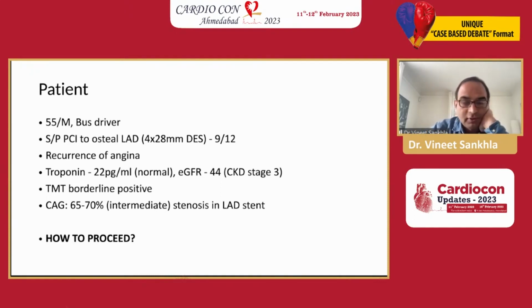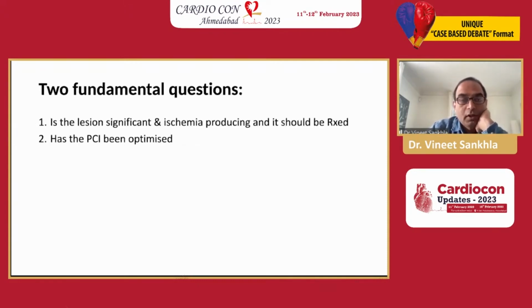Now, how to proceed? It's very important to know whether this stenosis is significant or not, because we have to treat him. Of course, medical treatment is there, but whether he will require any intervention, that is the prime question here. So two fundamental questions here. Is the lesion significant or not?